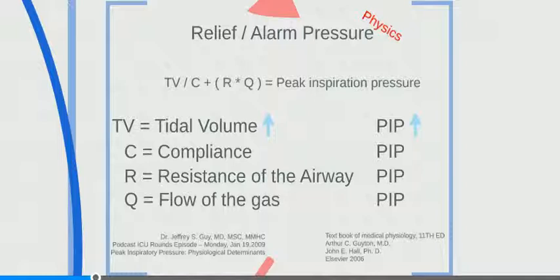It's going to increase your peak inspiration pressure. You're pushing more gas into this tank. It's going to increase the pressure inside, right? Fairly easy. Now, on the flip side of that, our compliance of our chest.